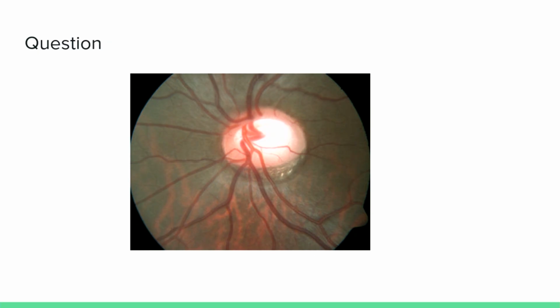Like what you are seeing, the blood vessel temporally, you can see there is a bend that signifies there is a defined margin there between the rim and the cup. Same thing with the bigger blood vessel also. But in between, you don't have any blood vessel that defines it clearly. So that could be a slope. Like you have a saucer for a cup, and for your coffee glass, you have that other cup underneath, which is sharp. That's an example.